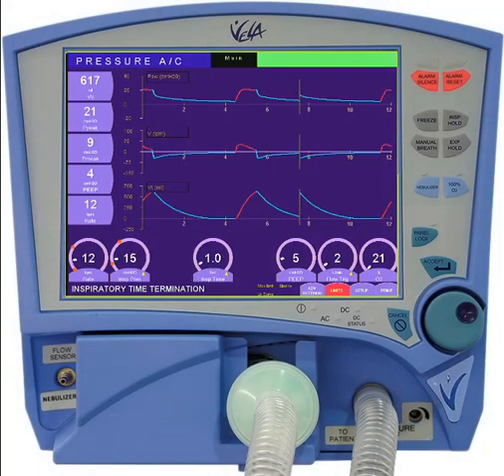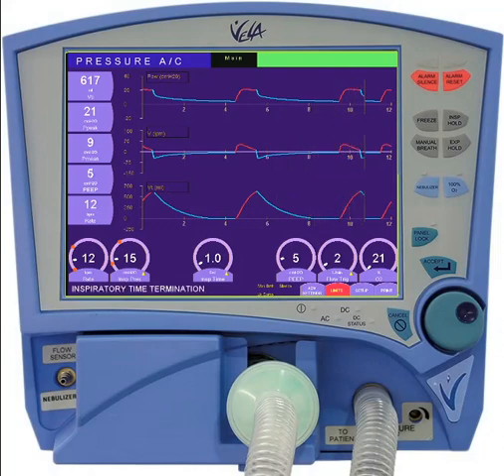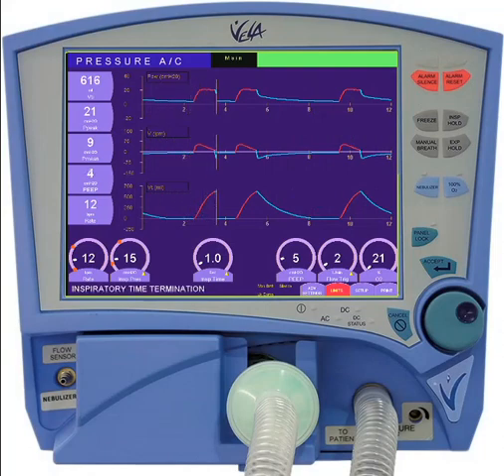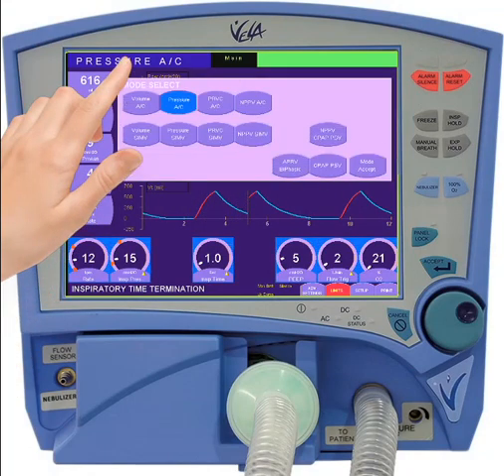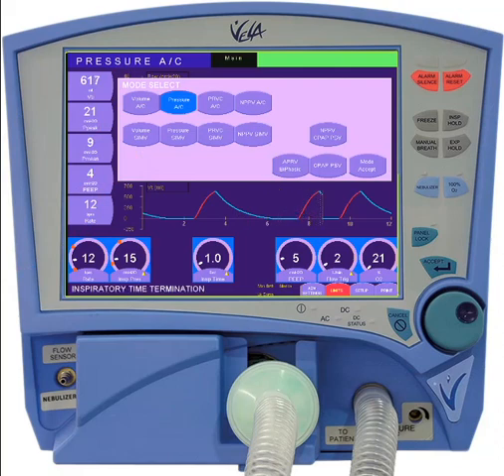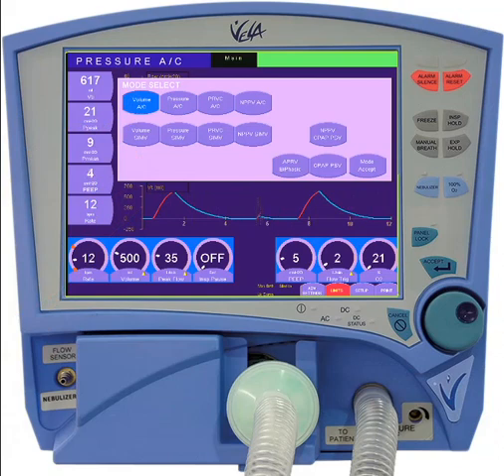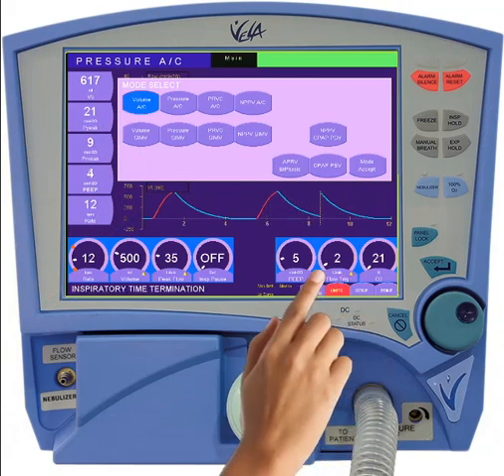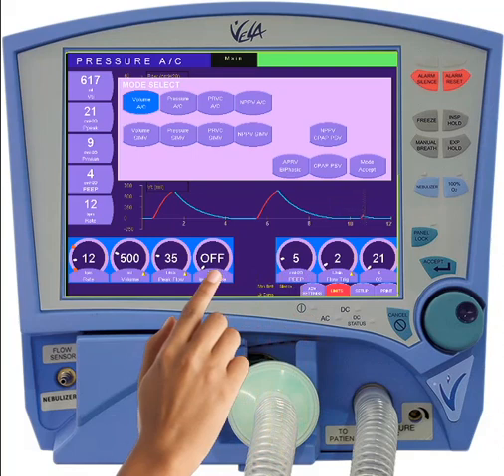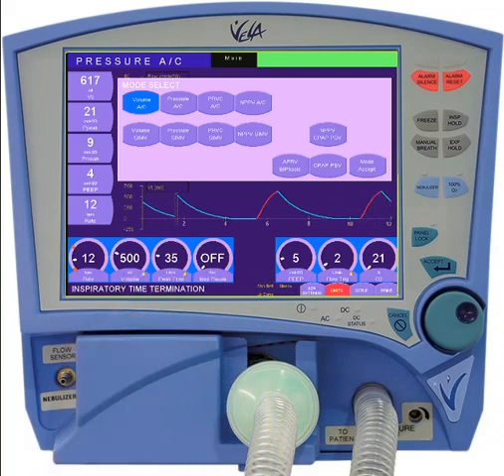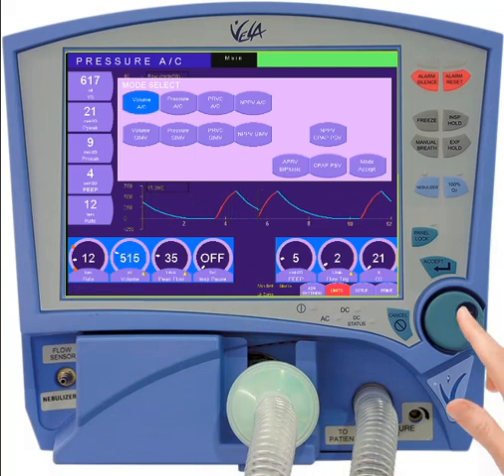To change the mode of ventilation on the Vela, you must first open the modes menu. This can be done by touching the banner in the top left-hand corner of the main display. When the window opens, you'll see a list of all available modes. Simply select the desired mode from the list. You'll notice the controls at the bottom of the display are highlighted in blue, indicating a block change, meaning you can change multiple parameters simultaneously when changing the mode.